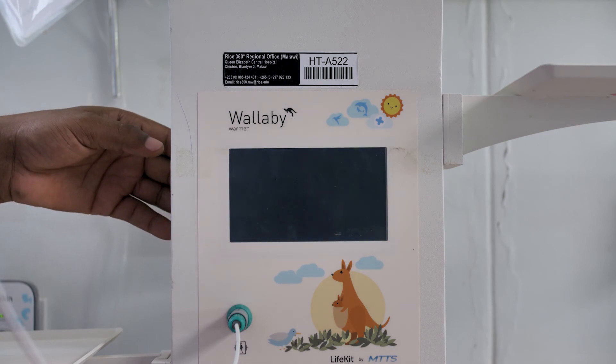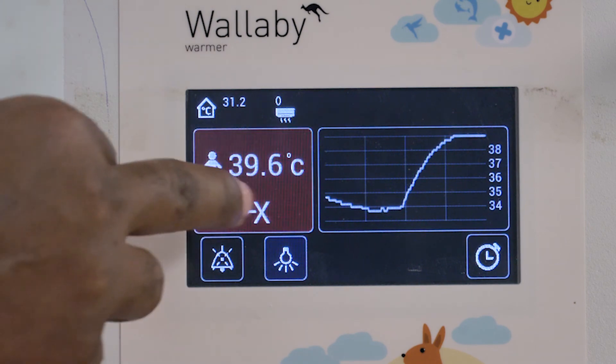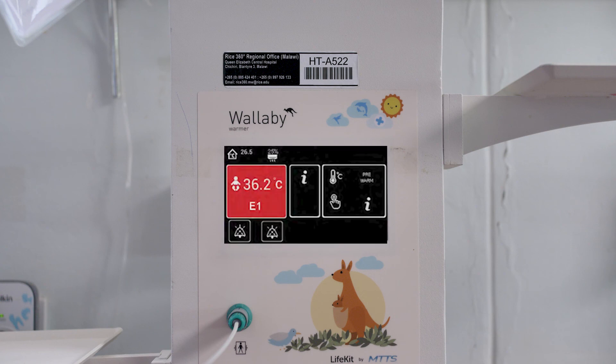Finally, if there is a power cut, this symbol will be shown. And if there is some other technical fault or system failure, then it will say E1. If you see this, then you need to contact the maintenance department.